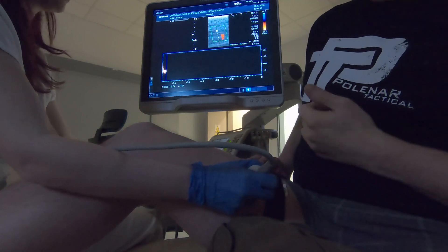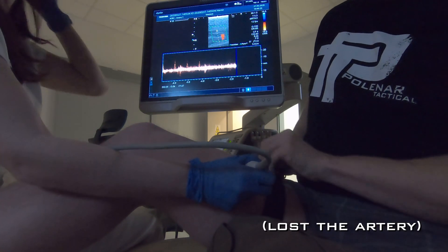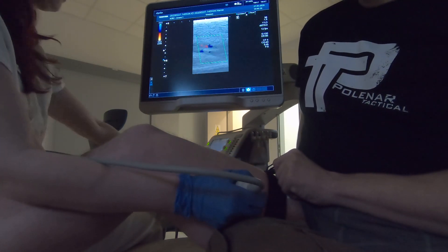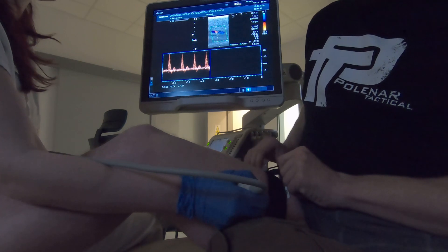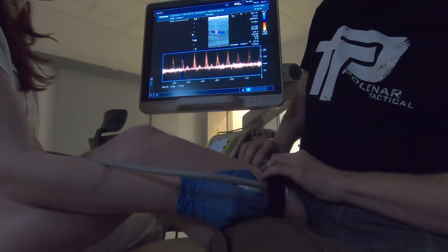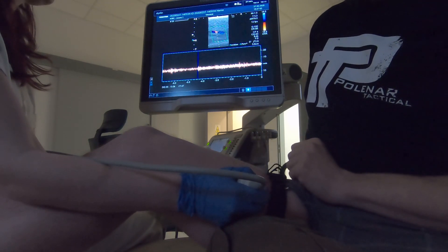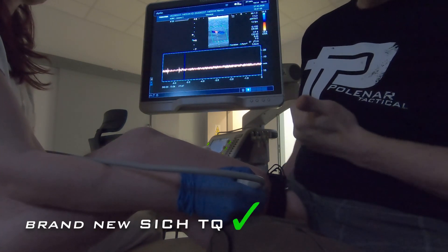So let's try to tighten it up. No signs of pulse, no blood flow. So it works perfectly.